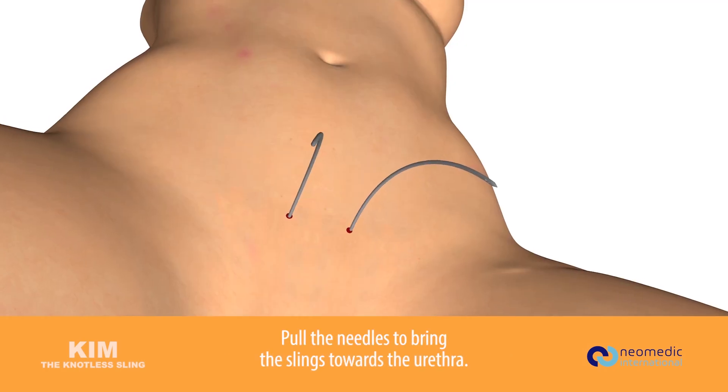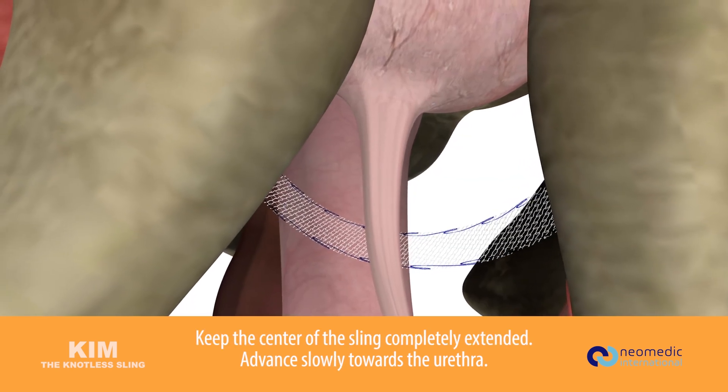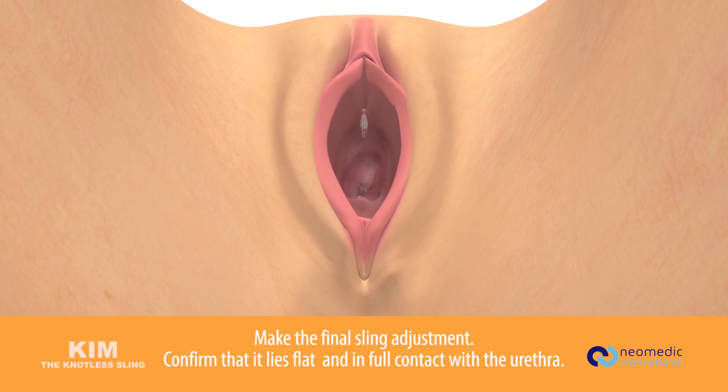Pull the needles to bring the sling toward the urethra. Keep the center of the sling completely extended and advance slowly towards the urethra. Make the final sling adjustment and confirm that it lies flat and in full contact with the urethra.